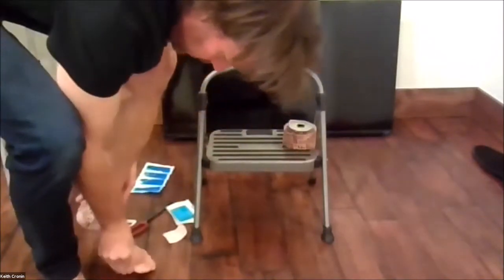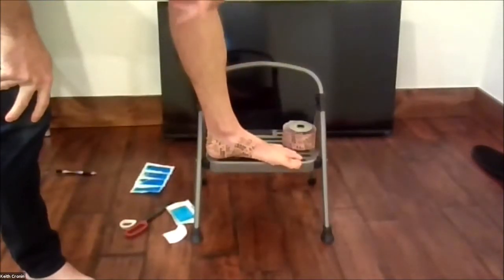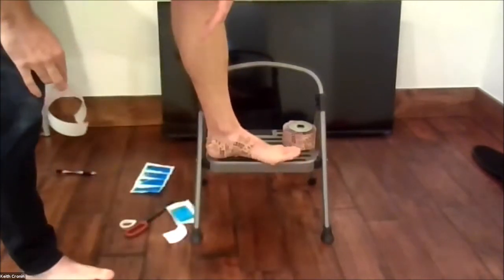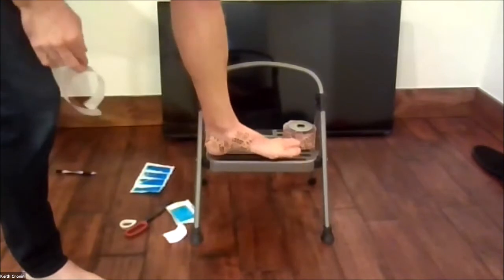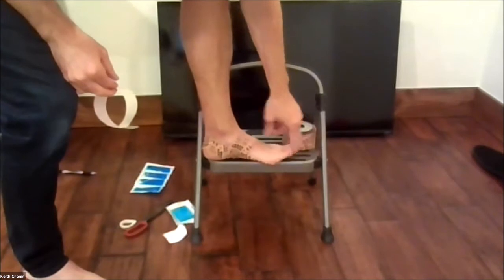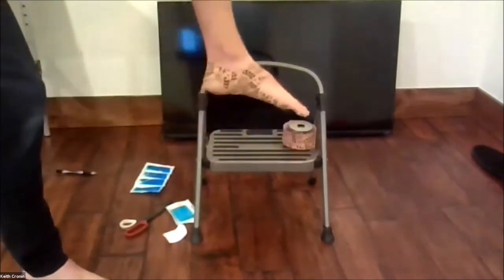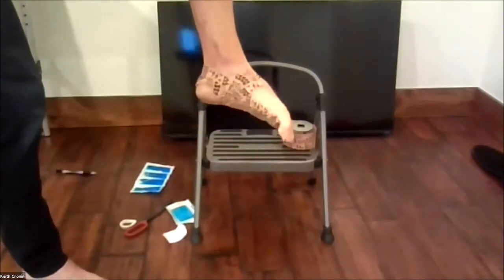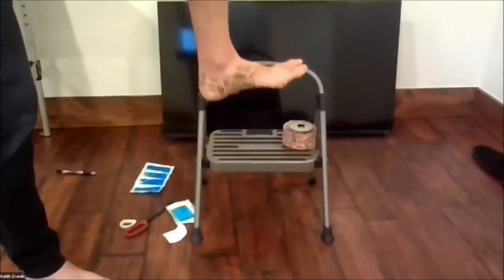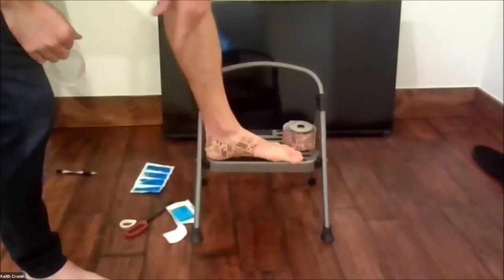Awesome. All right. So first of all, you will notice my foot looks way cooler than it did before. So if you know nothing else, put dynamic tape on your body, and it looks cooler. All right. I put it in a shortened position because as my foot pulls up, the tape is acting as a recoil, and it's springing everything. So as my foot is in a sitting position now, if you can see, it's kind of curled. I have to force it to open up. So when I put my foot down and load it, I'm now loading through the tape.